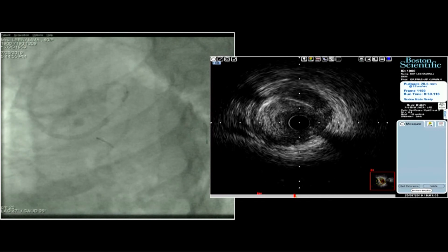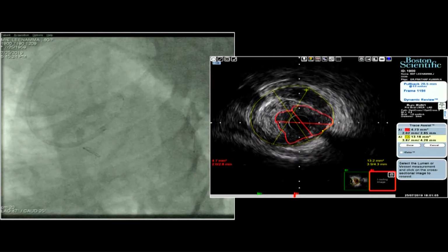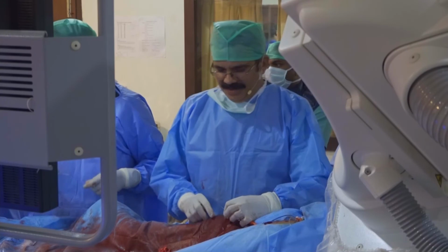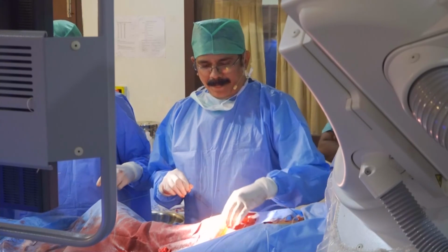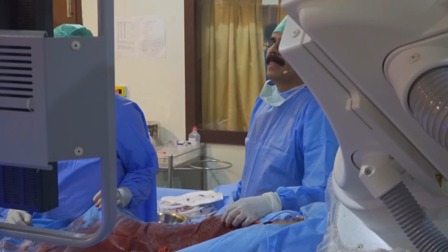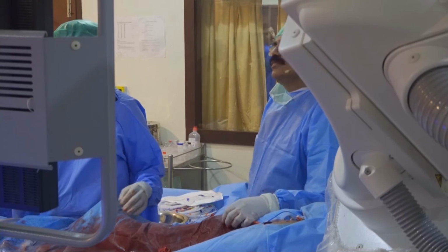Yeah, exactly. Other things. Prathap, you are worried that you might get cut off at any time, but we'll be with you till then. Thanks for the excellent demonstration. The antegrade technique could solve the purpose in this case, and retrograde was challenging. Sometimes life is funny; it shows different ways. We have seen Goel showing one left main crossover, and we now saw the ostial LAD opening. We'll probably finish it by positioning the stent right from the ostium to the LAD, without compromising the LCX. Any final comments, Prathap, before we close?